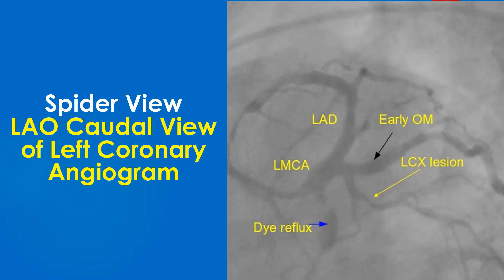Abbreviations used: LMCA – left main coronary artery; LCX – left circumflex coronary artery, with a lesion in LCX marked by a yellow arrow; LAD – left anterior descending coronary artery; early OM – early obtuse marginal branch of the LCX. Dye or contrast reflux into the aorta from LMCA is seen. Absence of dye reflux would indicate left main ostial disease or, rarely, spasm.